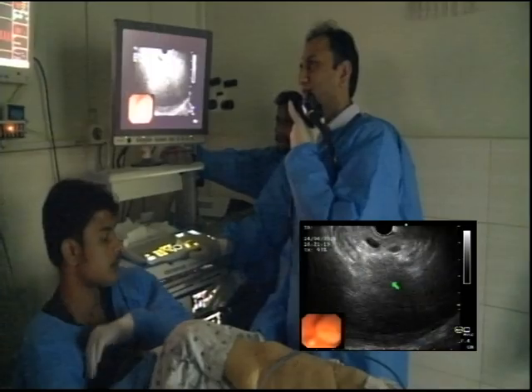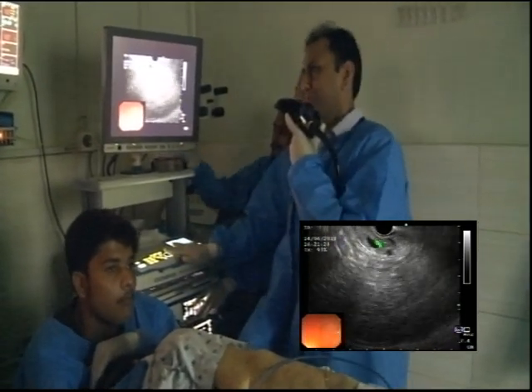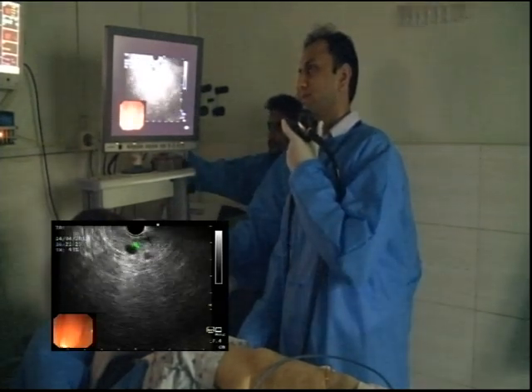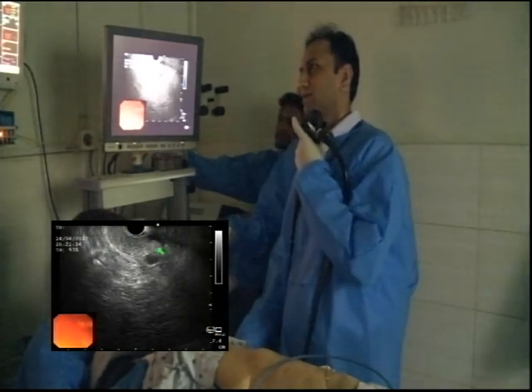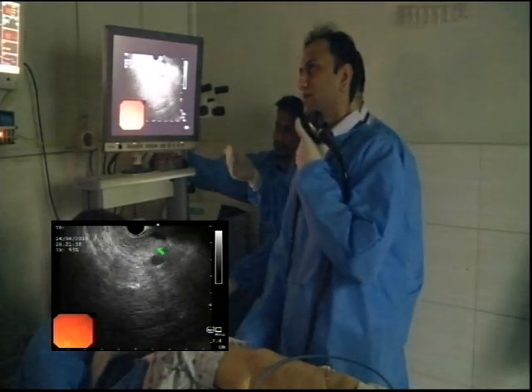Right. Relax your big wheel because you're pushing. Whenever you start seeing compression of the vessels, that means that your probe is pushing down on the structure. So at that point you have to relax. There you go. And here now you may make out the pancreatic duct. It's not relevant to this case. Okay. So we can generally move on now.